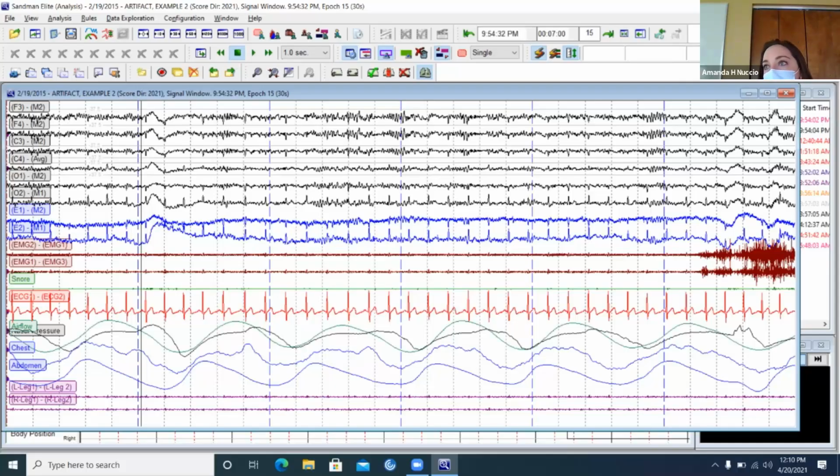So it's not like a continuous stream of information that's coming through. Just think of a video, the video quality. You get these security videos where it's a very jilted kind of video. That's because the sampling rate is low. It's only picking up maybe 5 frames per second. So it's kind of like a jilted video versus a camera that has a better, higher sampling rate. Maybe it's picking up 20 frames per second. It's a lot smoother. You're getting a lot more of the pictures coming through.